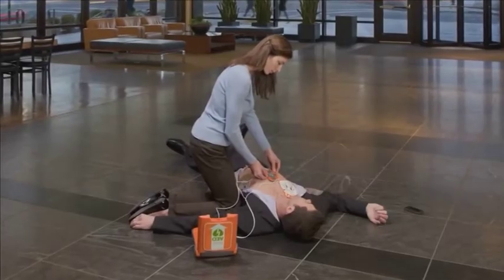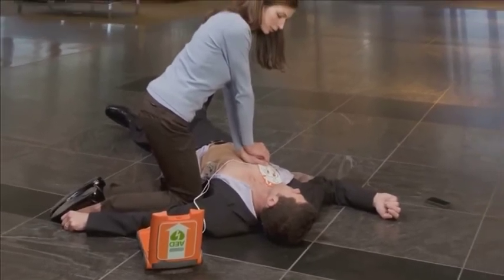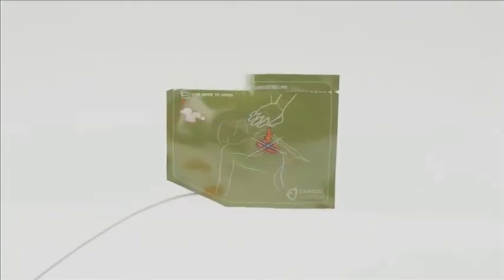The G5 AED knows which electrodes are connected to the unit. The G5 will also know if there is a CPR device connected to the electrode pads. If the CPR device electrode pads are connected, the AED will guide you through removing the CPR device from the green package in the lid of the AED.